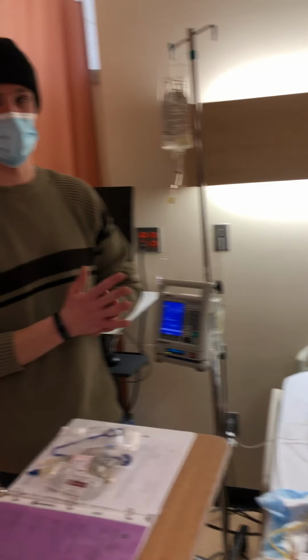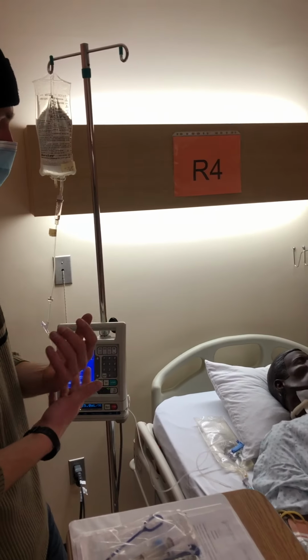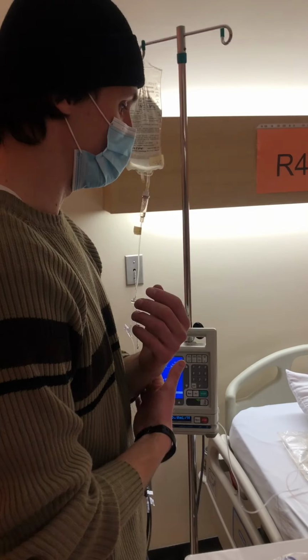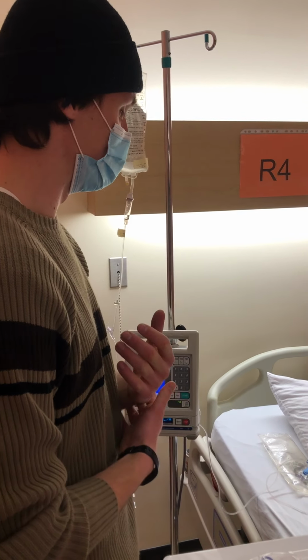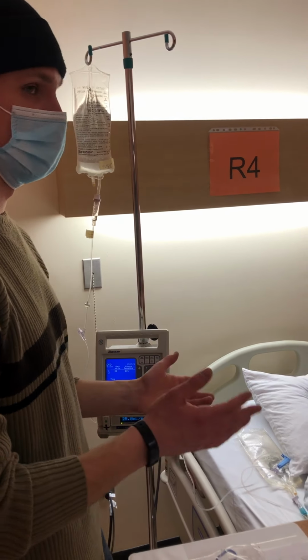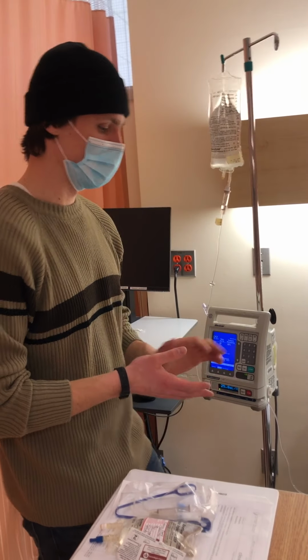So now I'm just going to educate the patient. So Dory, today I have cloxacillin for you. It's an antibiotic that will be used to treat your infection, your cellulitis on your left arm. You can expect nausea and diarrhea. Do you reject this medication? They say no. Ask if they have any questions. They say no, they're good to go. So I can go ahead and proceed.